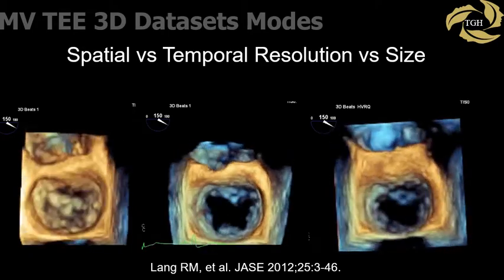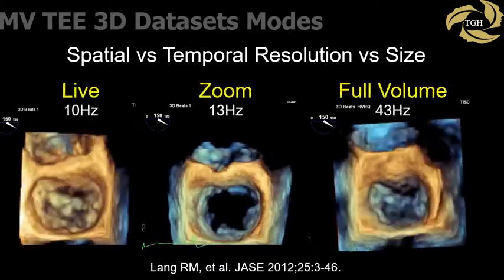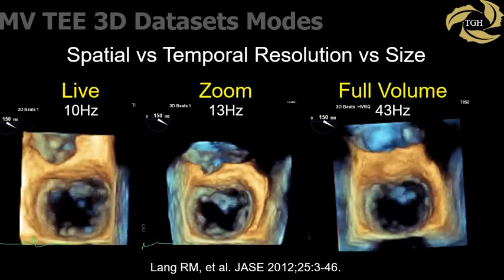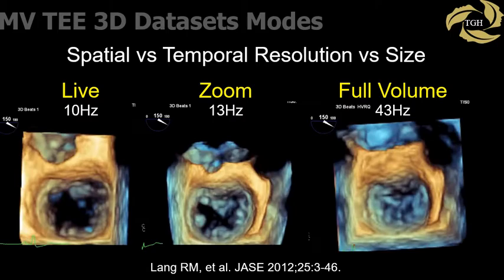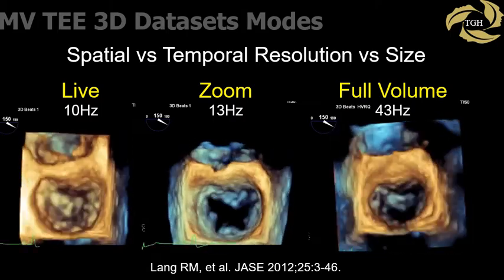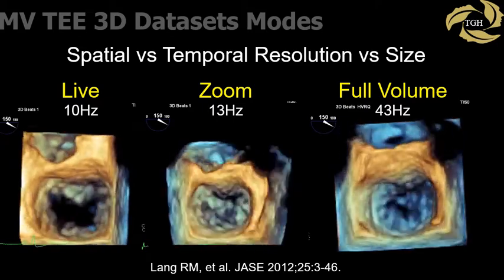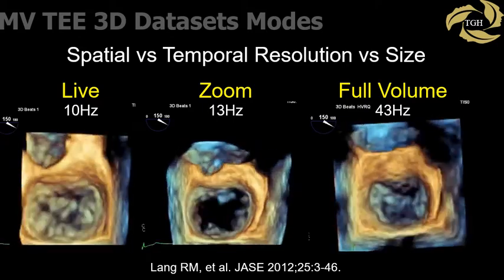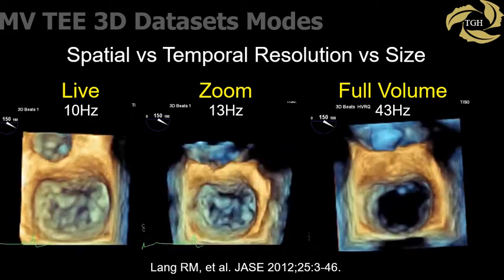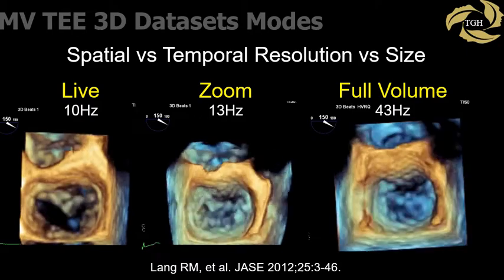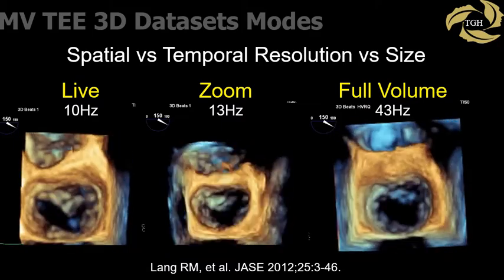These are different options for acquiring a 3D mitral valve dataset: live, zoom, or full volume. Each is chosen to optimize spatial or temporal resolution. Improving temporal resolution may require multi-beat acquisition. Live previously provided only a small volume, but recent software can expand to image the entire valve, though with poor temporal resolution. Zoom is often used to image the mitral valve as it can be centered around the region of interest with multi-beat acquisition to provide good spatial and temporal resolution. Full volume provides the largest dataset and requires multi-beat acquisition; stitch artifacts are common.